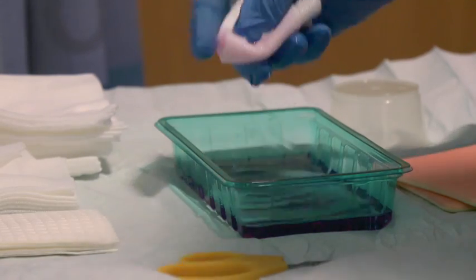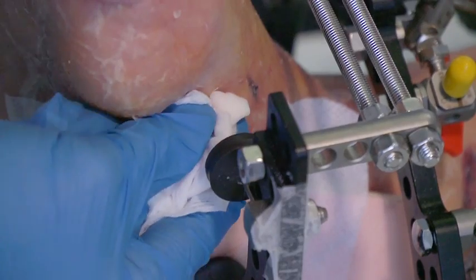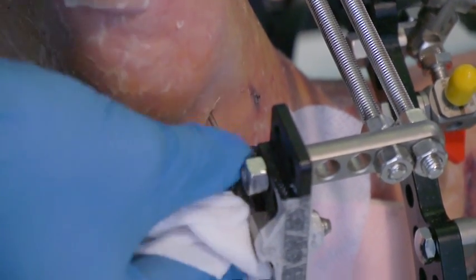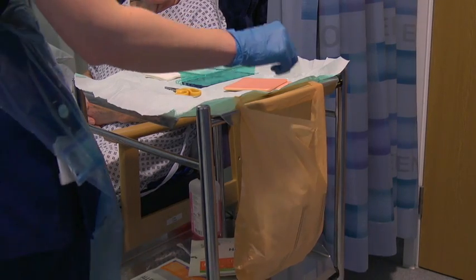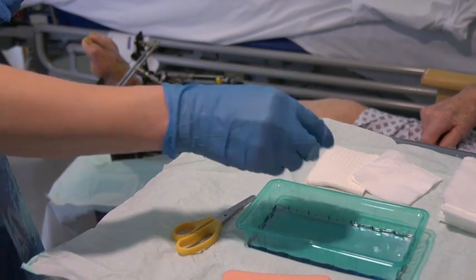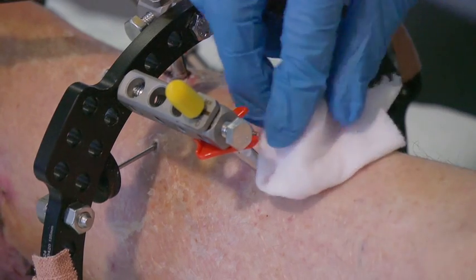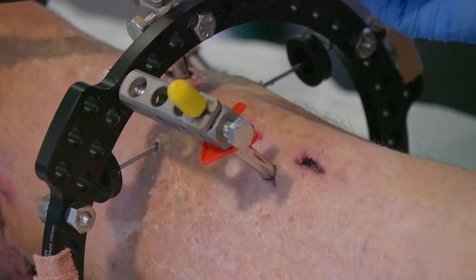Clean each pin sight with the pink antiseptic solution, making sure you use a separate piece of gauze for every pin sight to prevent cross contamination. Any crusts or dried ooze should be cleaned away from the pin sight, but don't pick off any scabs or plugs formed around the pin sight, as these help to close the hole and prevent infection.